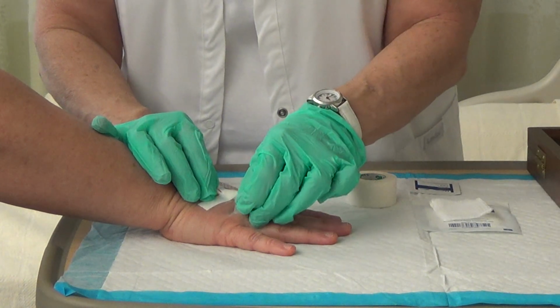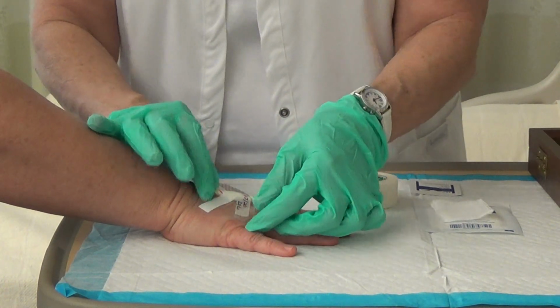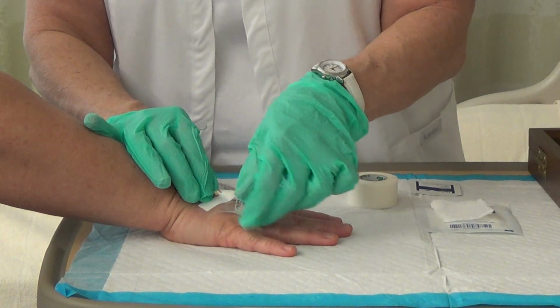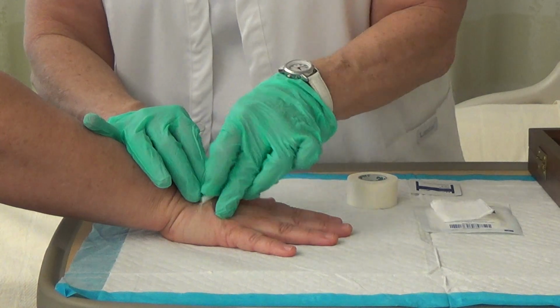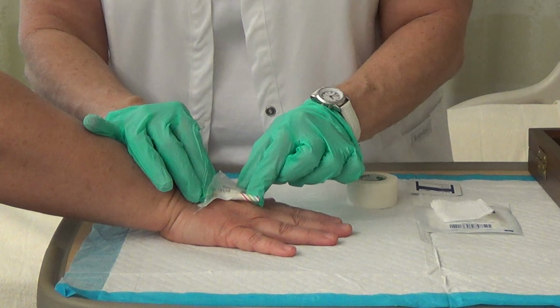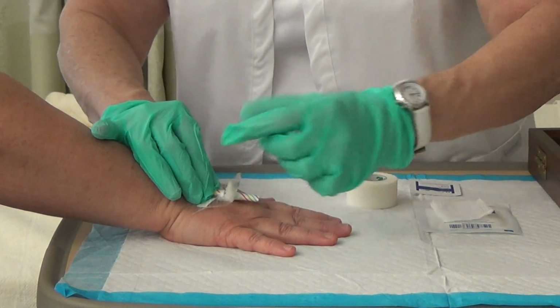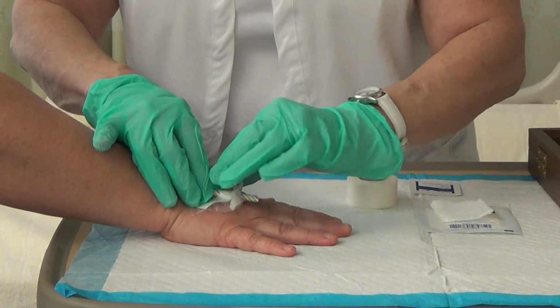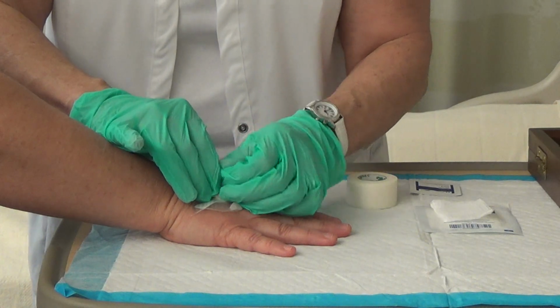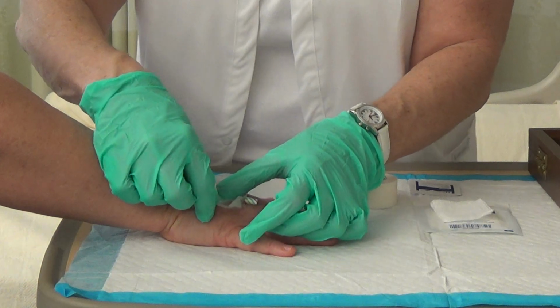So we're just going to slowly, this is a Tegaderm, it's a see-through tape, and then the white part is called a chevron. Now there's some controversy right now with the Intravenous Nurses Society on whether we should chevron IV sites or not, because they feel like it's a source of contamination to the site. So that may change and you may not see the use of those. And just go kind of slow, hold that IV site, hold the skin down, because these Tegaderms kind of melt into your skin and it's not comfortable when you take them off.